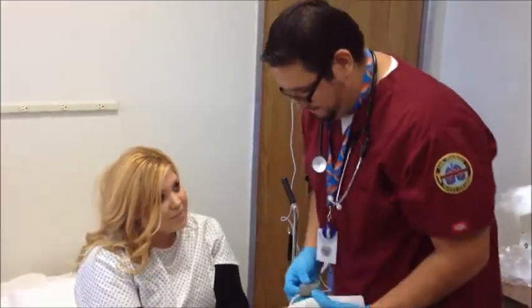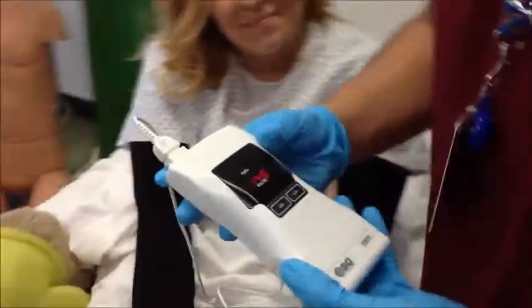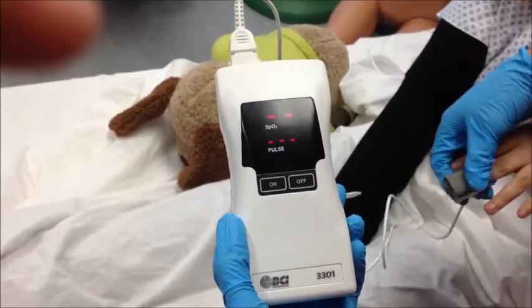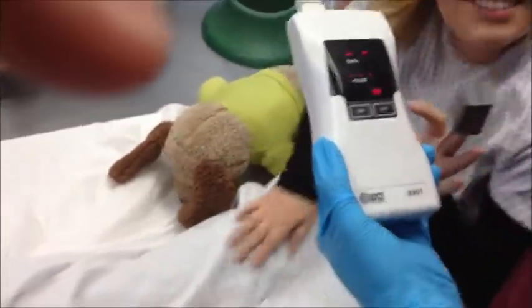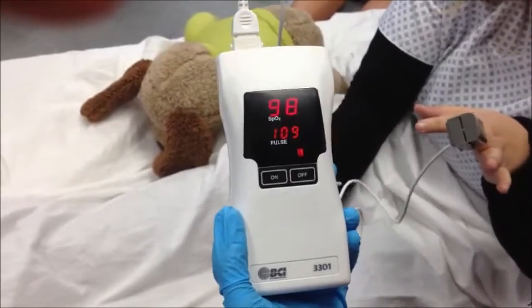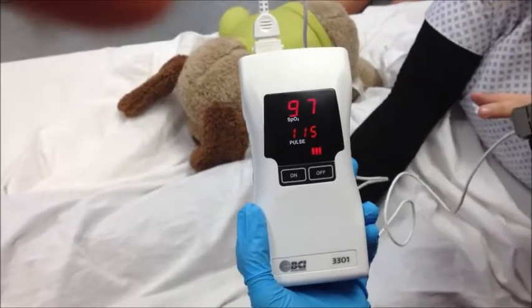Go ahead and give me that middle finger again. Which way? This way. Just kidding, honey. Let's see if her oxygen level has increased any. I don't think your machine's working. Now, these little technology things — we didn't have them back in my day. Alright, looks like we've got an O2 sitting at 97%.